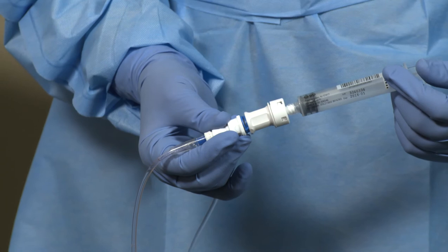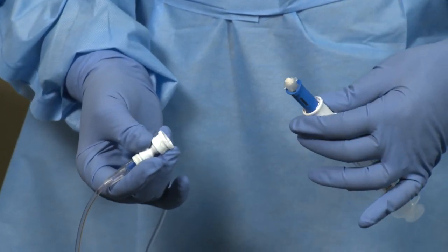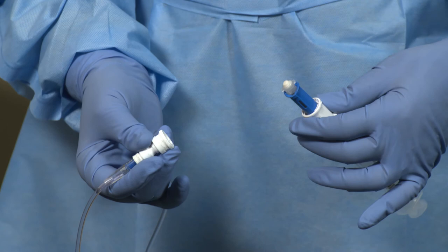Afterwards, disengage the syringe unit from the BDFASIL connector using the pull-turn-pull technique. Discard the syringe unit without disassembling according to your facility's protocol. The BDFASIL connector should remain connected to the IV line and should be discarded intact when the tubing is removed or changed.